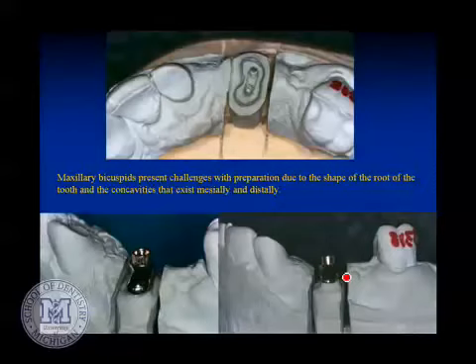Because all of your patients are that compliant. Okay, mine aren't, but I'm sure yours are. So that down the road a piece, you can run into problems with recurrent caries in these areas on maxillary bicuspids or any tooth that has a significant concavity mid-proximal from buccal to lingual.